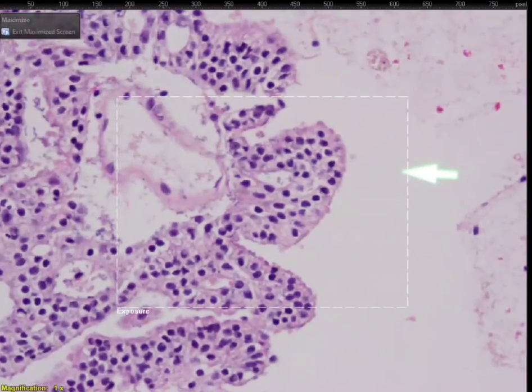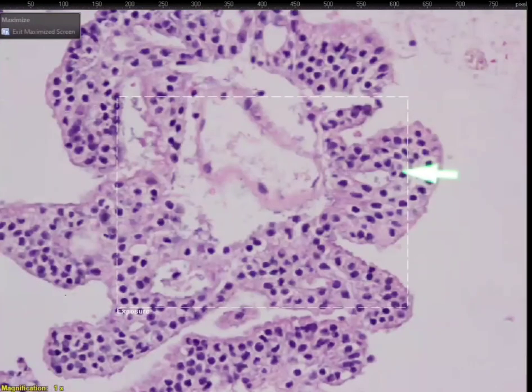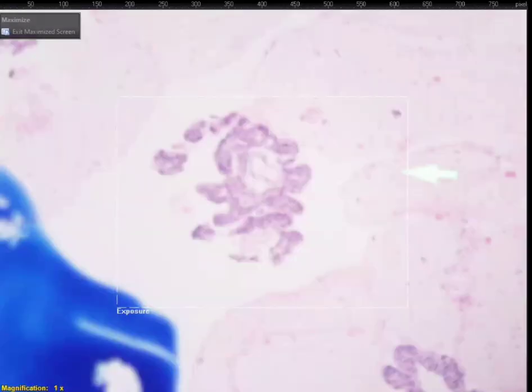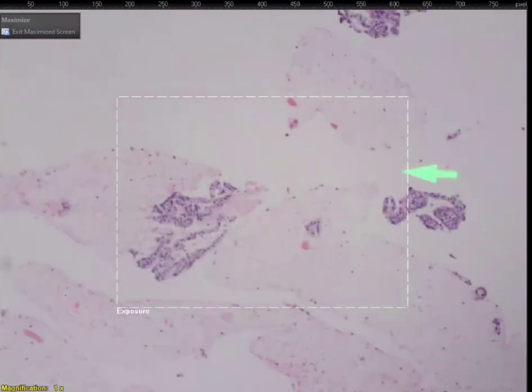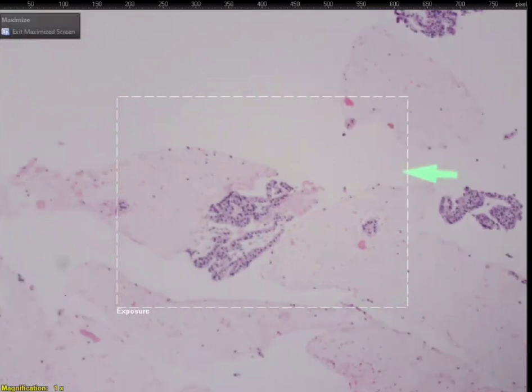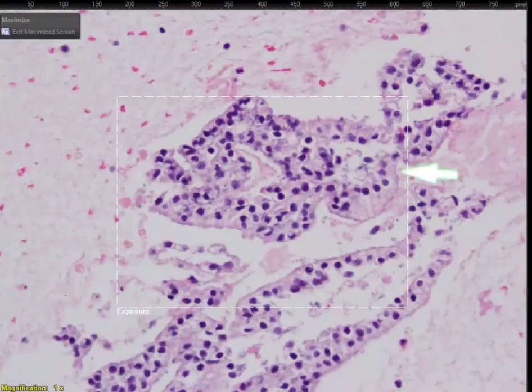No, there is some gland formation here, which is not appreciable on that one. Exactly, yes. Looks like little gland formation. So more suggestive of an adeno. Is that what you are saying, Dr. Mushtaba? Yes, right. I think those are nuclei now. Now let's look at the compact nucleus. Still some look very compact, very uniform, very round.